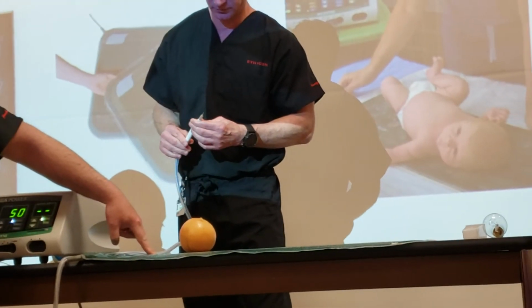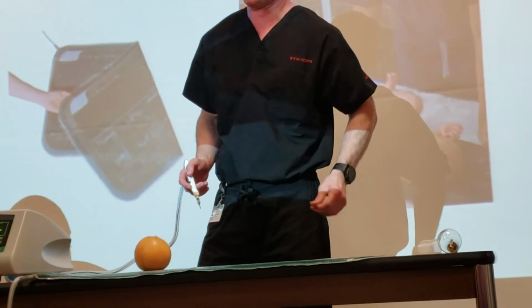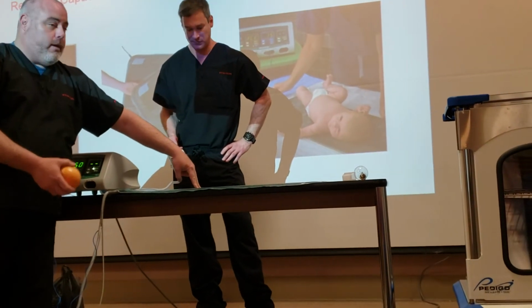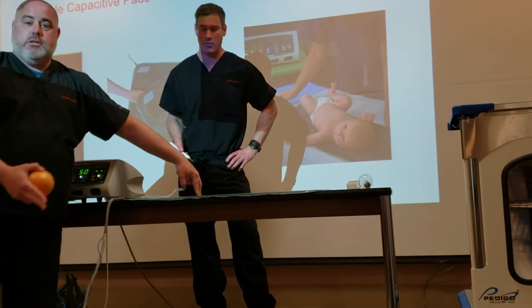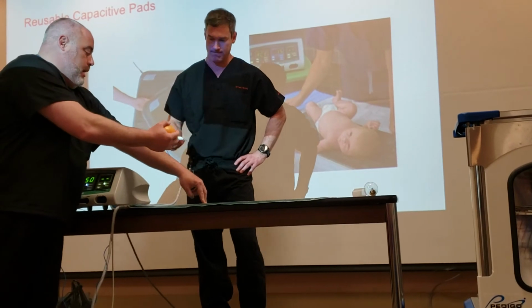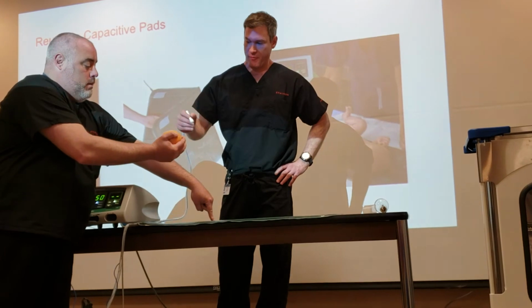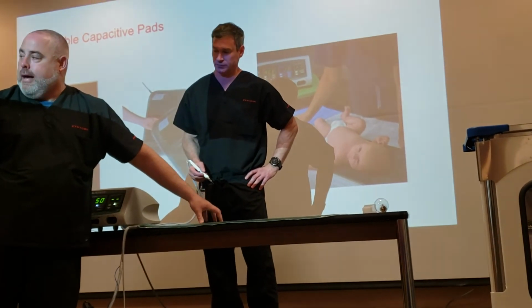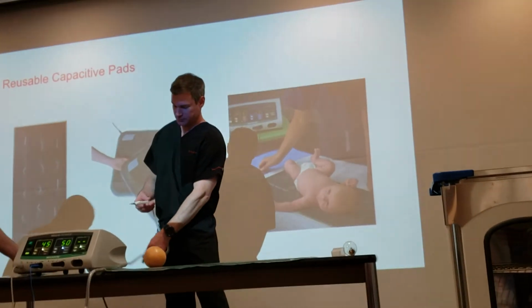Not a lot. So what's happening is, do I have electricity going through me into the pad? I don't. Remember, high current concentration, right? I just have a couple fingers here. Again, there's nothing passing through me into this pad. It's simply being induced through an insulator. So when Ryan hits that, I'm gonna just do one finger. Go ahead. You get electrosurgical effect, and I'm inducing current through my finger to the other side of that pad. Okay? So there are incredible safety considerations there.